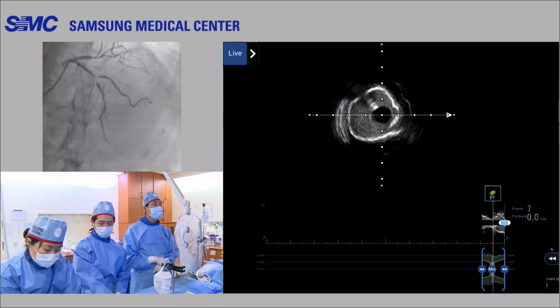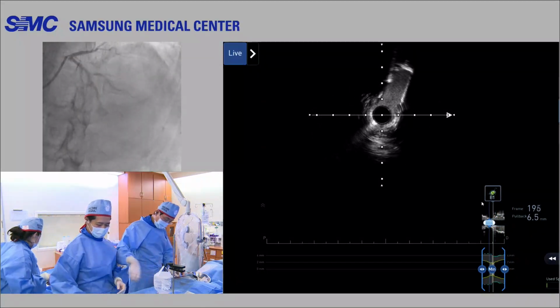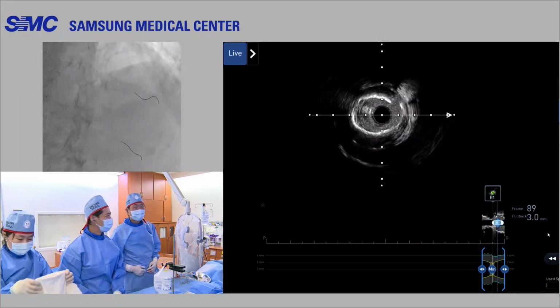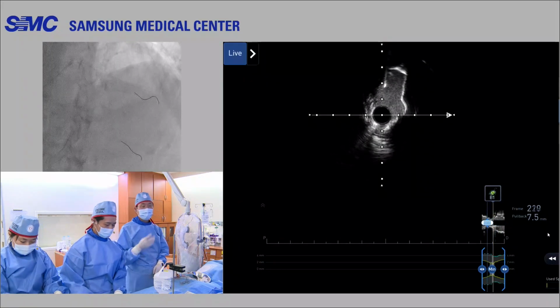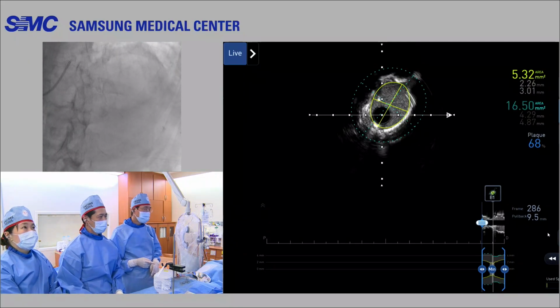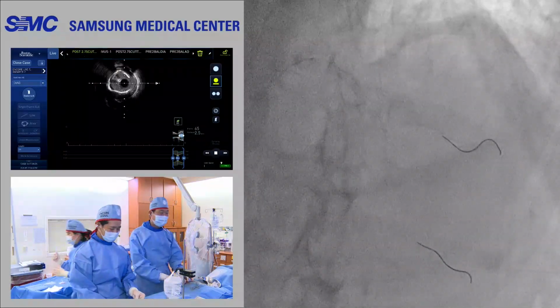Okay. So please show us the angio. Dr. Hong, what do you think? No, keep going. If this is my patient, I do a stent. Based on angiography at this point, what do you think? In that case, we need angiography.